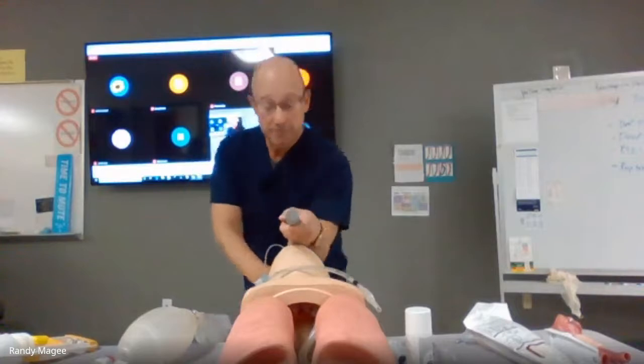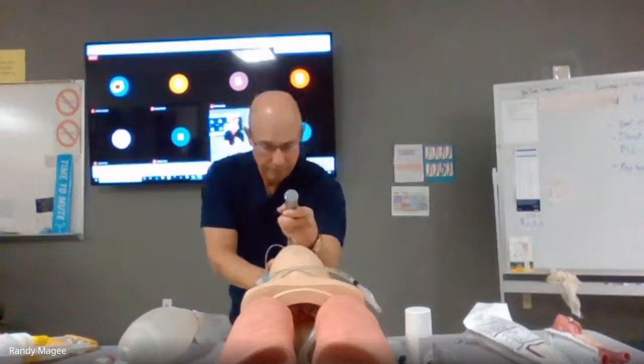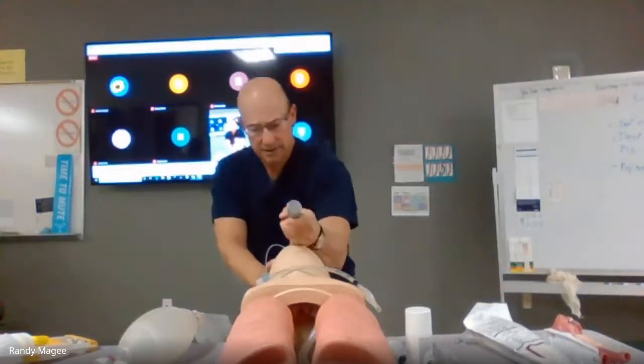So I'm going to go in. I'm going to stabilize. Might need someone to hold this down for me a second.